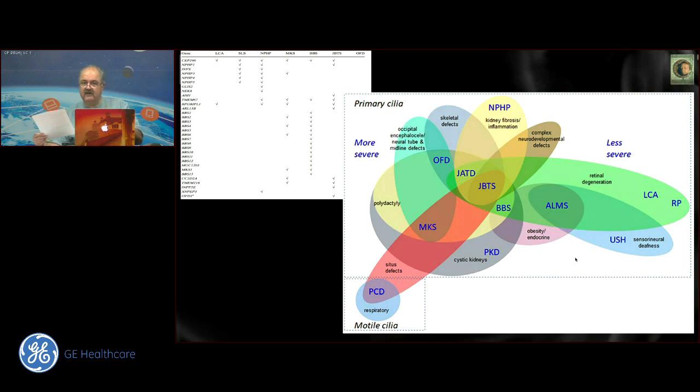And then if you find a bad looking kidney with polyhydramnios, then again you start thinking in terms of Bartter's, because that's truly what it is, that these kidneys don't really have a structural disorder in that sense. They have a tubular disorder, or a nephronic disorder as we like to call it, and that there is polyuria and therefore a polyhydramnios.